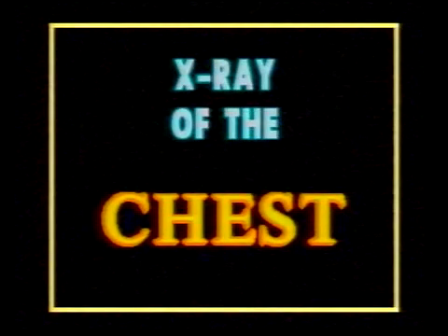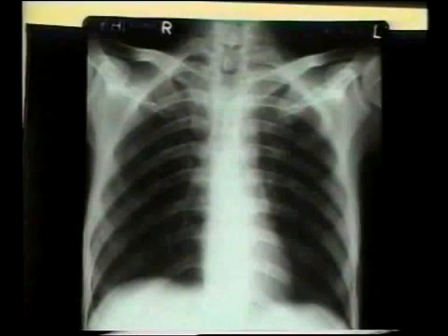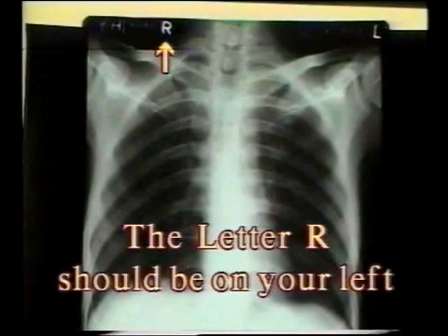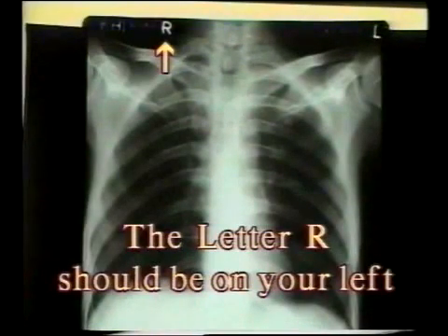X-Ray of the Chest. The first step in reading an x-ray film is to hold it correctly, upright and with the letter R on your left side, as if the patient is standing facing you.